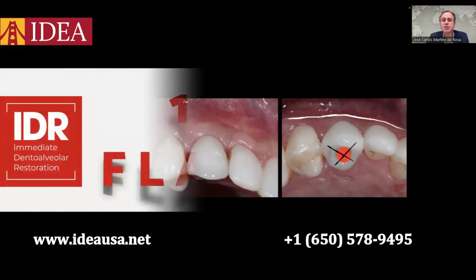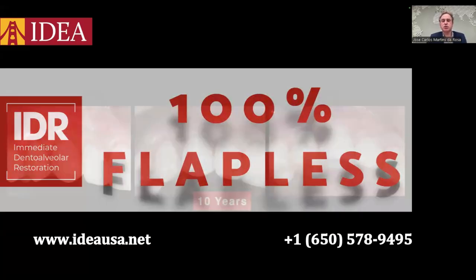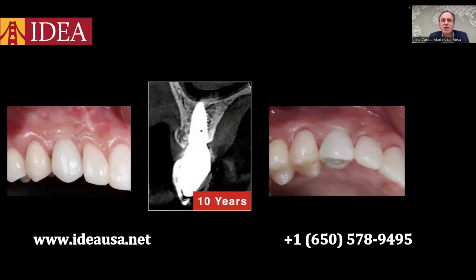So this is 100% flapless surgery using triple graft from the maxillary tuberosity. And this is the post-op after 10 years. The gingival architecture is being maintained in the same position that we had 3 months after the surgery. And look at the new buccal wall completely remodeled.